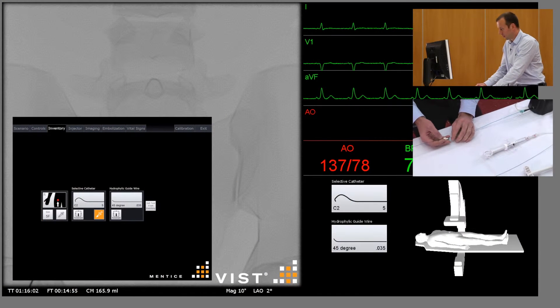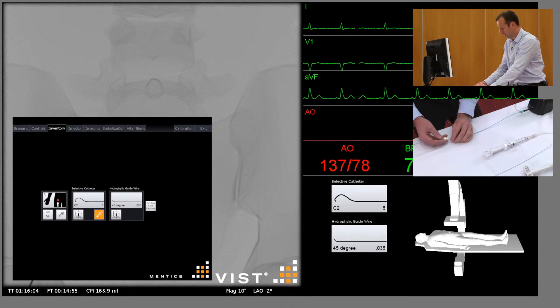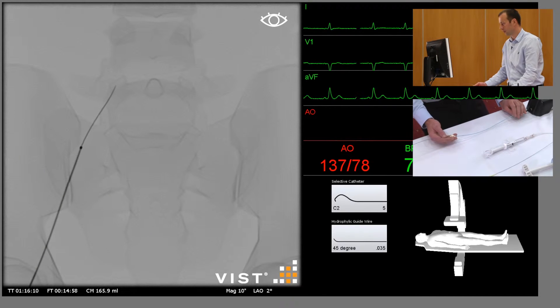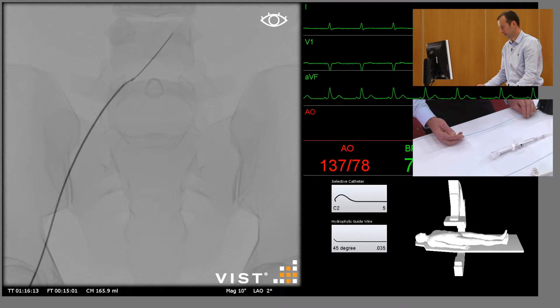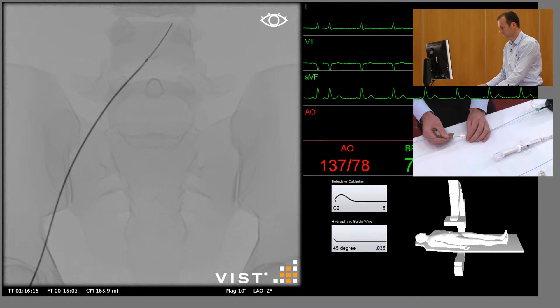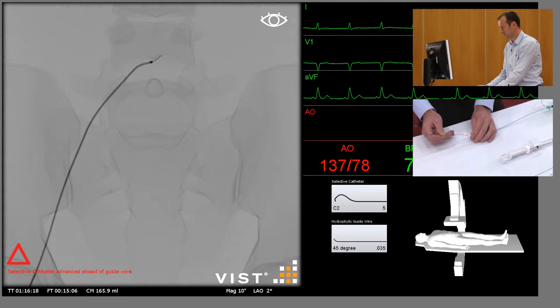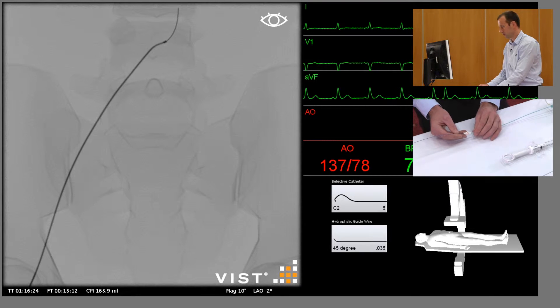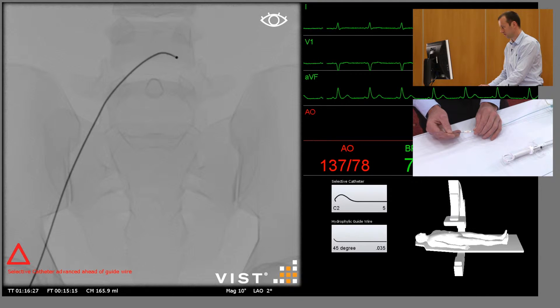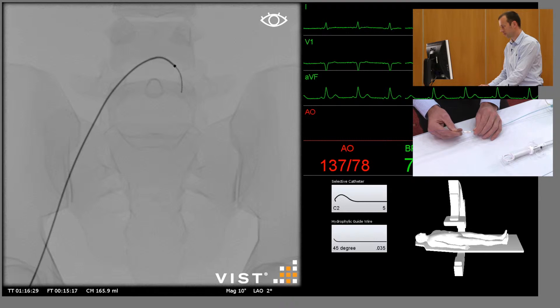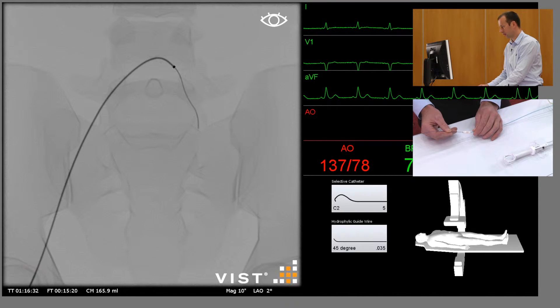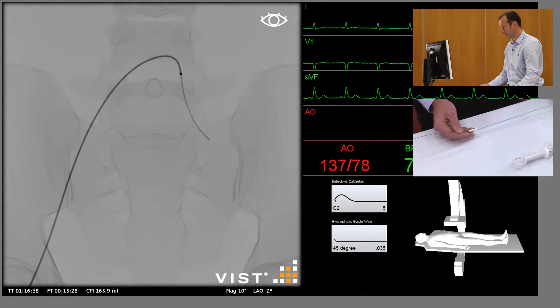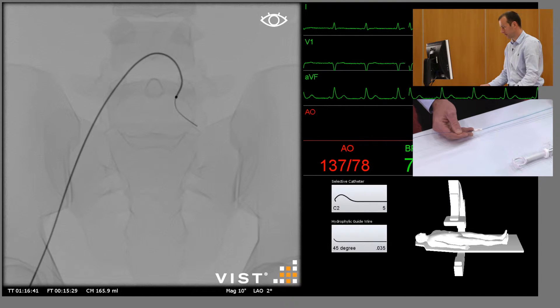We're going to start with a COBRA II catheter and a hydrophilic guide wire which we've pre-selected. I'm going to use this combination to cross the aortic bifurcation as we've shown you before, so we're going to advance the COBRA catheter into the proximal left common iliac artery.